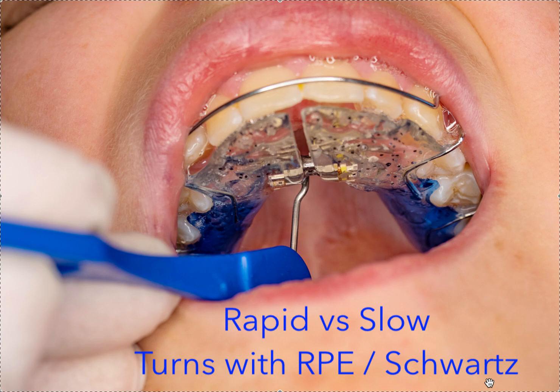The other suggestion I have for you whenever you're doing expanders is to make sure your office knows that first of all, no expander patients walk out without an appointment. Everyone has an appointment in 3 to 4 weeks. Everyone does, okay? Not an option. And if they cancel an expander appointment, you're following up.